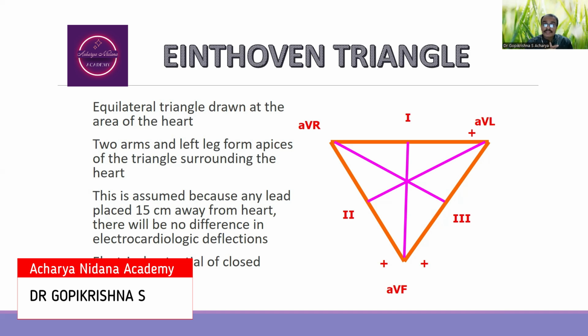So as per this principle, if any lead is placed 15 centimeters away from the heart, there will be no difference in the electrocardiographic deflections taking place.